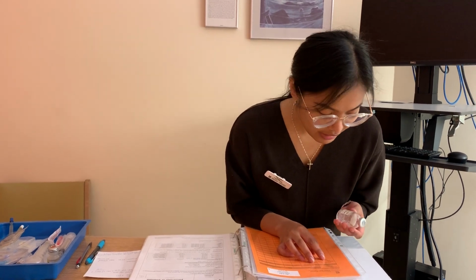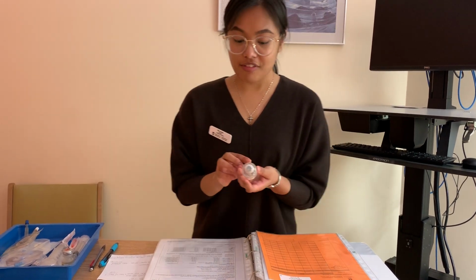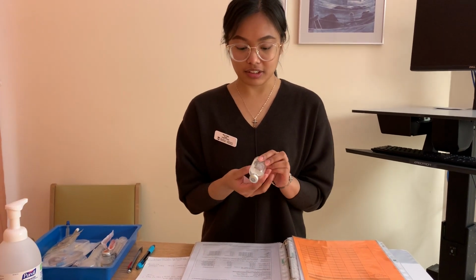And right route is IV. It does indicate that it's IM or IV only, so we can give that. And right time frequency is every 6 hours. So it hasn't been given yet, and we can give that now. I'm checking integrity of the vial, noting that it's still intact, there's no cracks, and it's not expired.